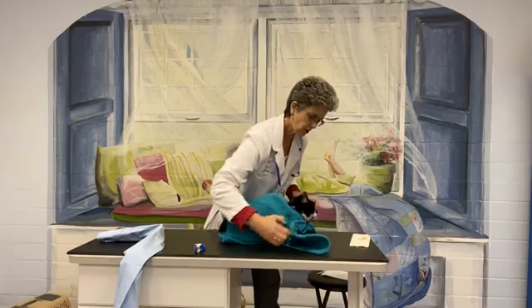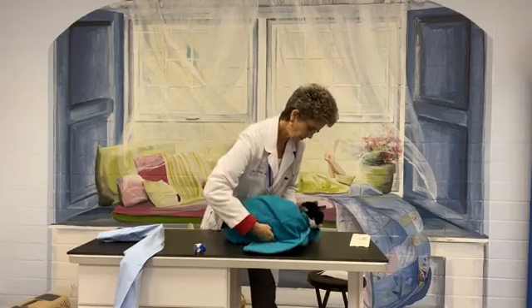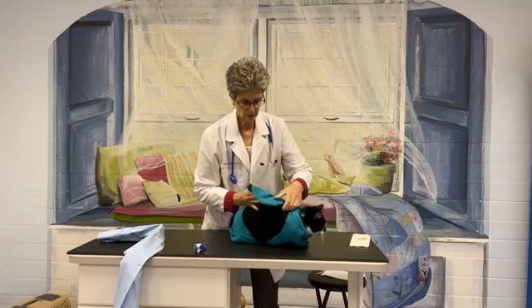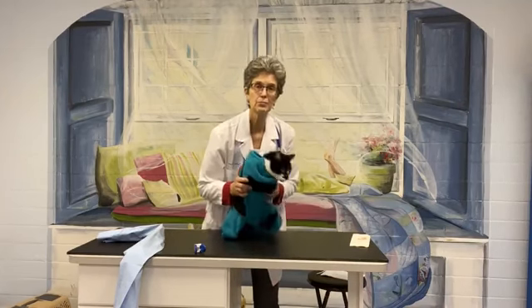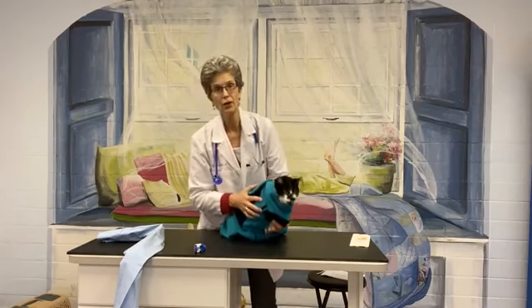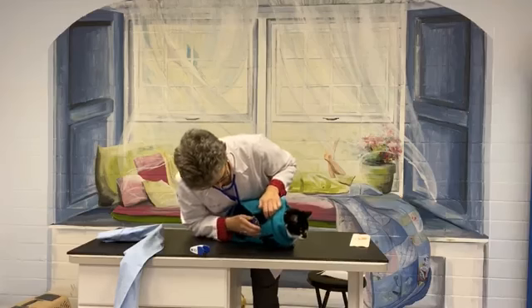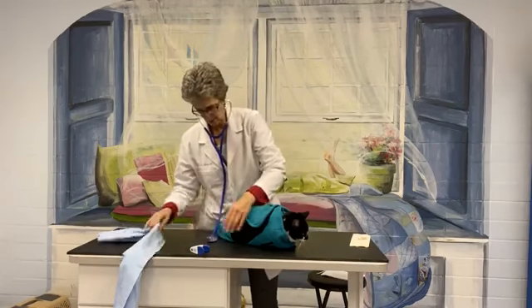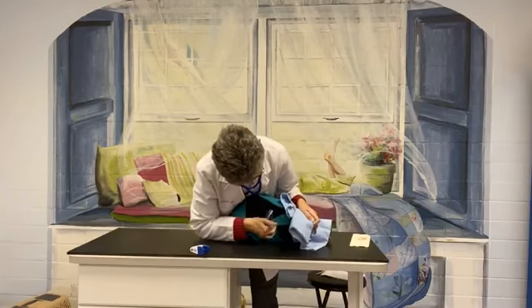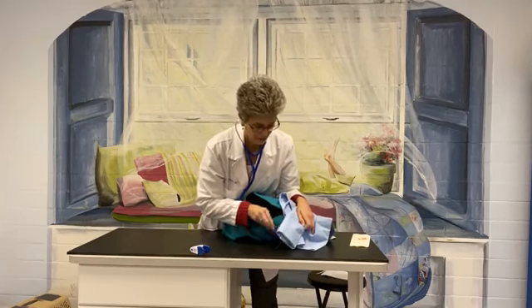Okay, so now the front, so you can see he's pretty well encased already. A lot of cats like the added snugging, if you will, of taking these slide wraps and coming around and then coming around again. Okay, so now he's bundled up. Now, these two points here come open, so I have a little window. To listen to his heart and lungs, I can put my stethoscope on. If I was concerned about bite risk from his head because it's exposed, I'm sorry, this is not a thick towel, but I could hold his head like so, roll him to the side, and slip my stethoscope in to listen to his heart and lungs.